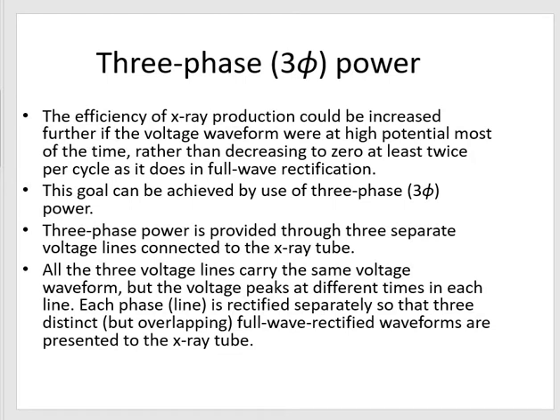Power is supplied to the X-ray tube because the X-ray tube requires electrical energy for only two primary purposes. One is for the filament to boil off the electrons from the filament, and second is to accelerate these electrons. And these two circuits run at completely different voltage supplies.